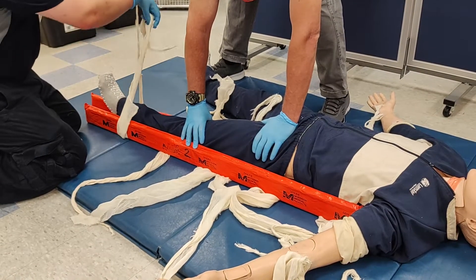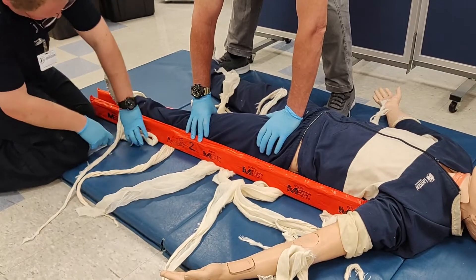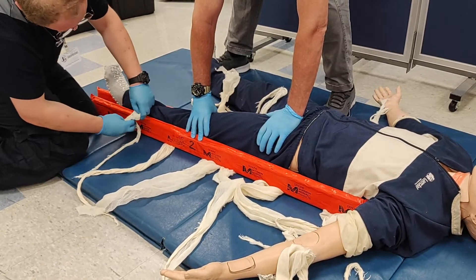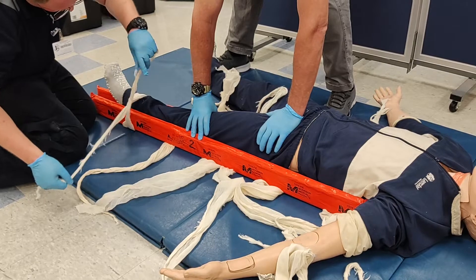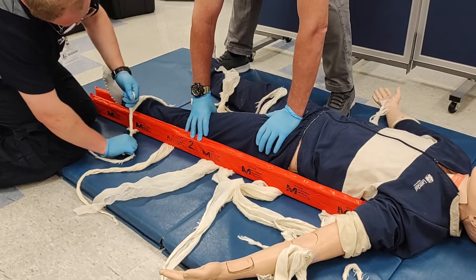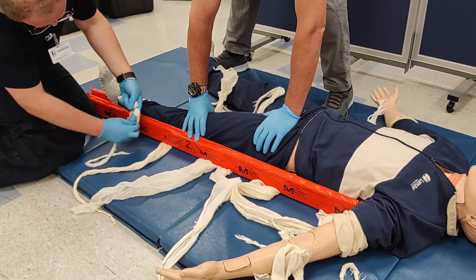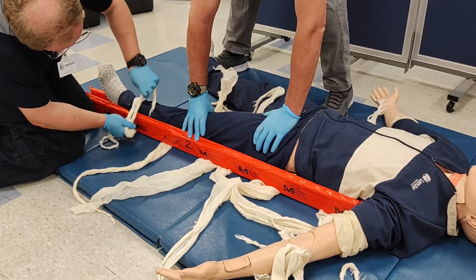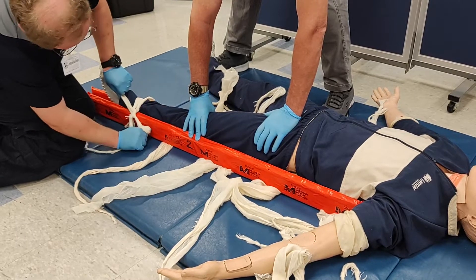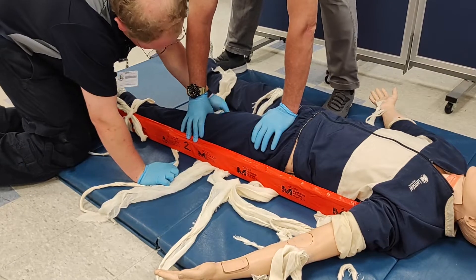As you tie the cravats, ensure good tightness, placing the knot over the splint itself and not over any voids or over the patient. It is likely that these cravats and their knots will loosen over the application of the splint, so be prepared to revisit.